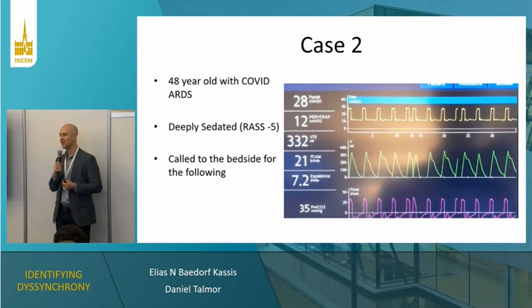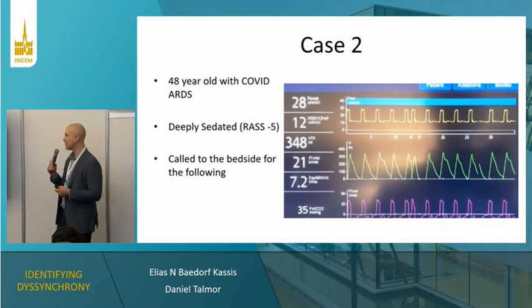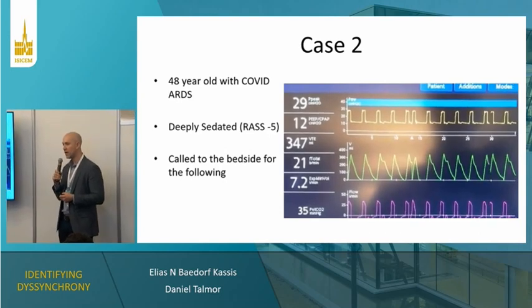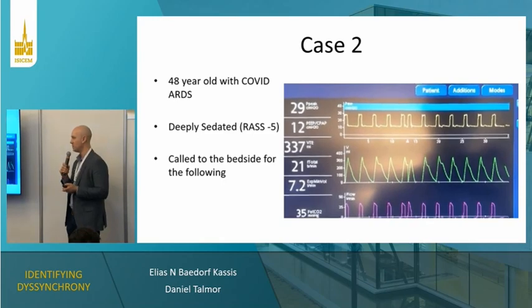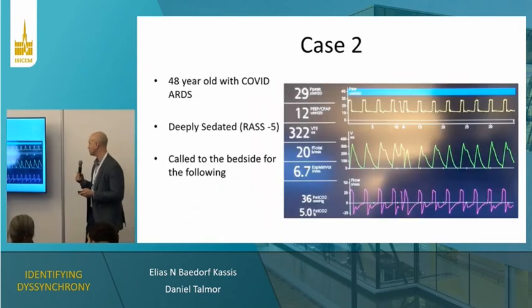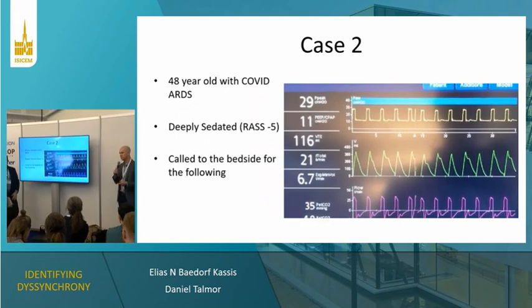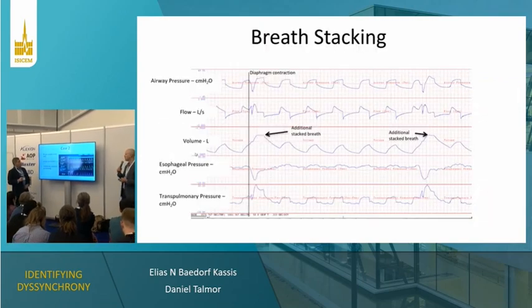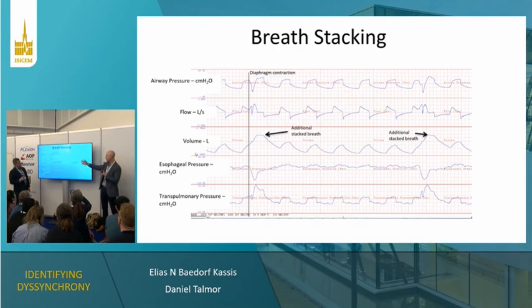Do I hear reverse triggering out there? Very good. This is important because reverse triggering and double triggering both can cause breath stacking events, and it's really important to differentiate the two from each other. The fact that the ventilator breath comes first here is really pathognomonic to identifying reverse triggering. And again, this idea about breath stacking is that the ventilator underestimates what the volumes are being delivered here.